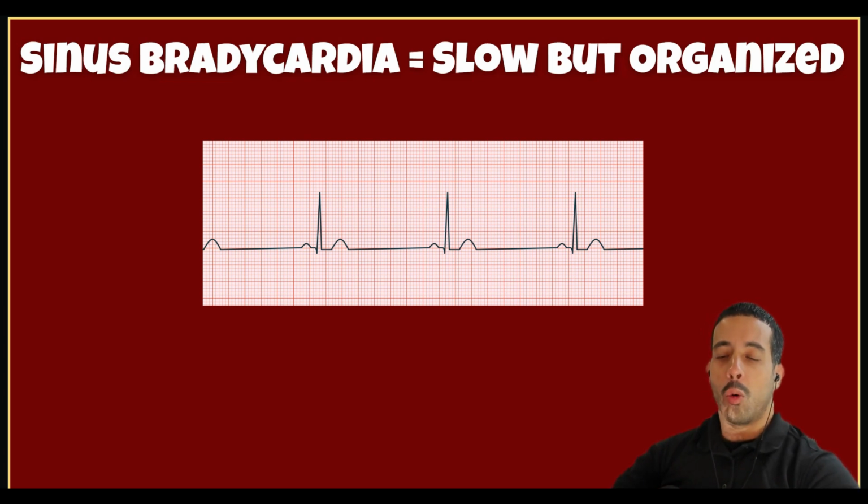People get treated with atropine and pacing when there is a need. And how do we know there's a need? When there's symptoms. That's why they call it symptomatic bradycardia. So what you're seeing here is normal P waves, normal QRSs. The QRSs are not wide, and everything is showing to be from a sinus origin, and that's obvious by the upright P wave. Now, remember, if there's no symptoms, there's no need for acting. There's no need for medications.